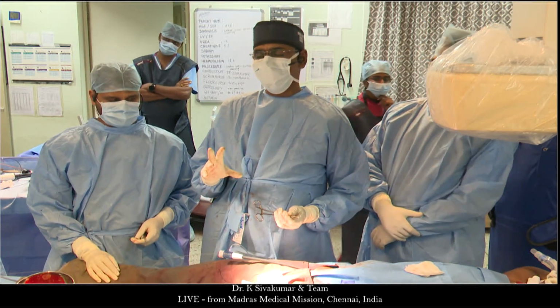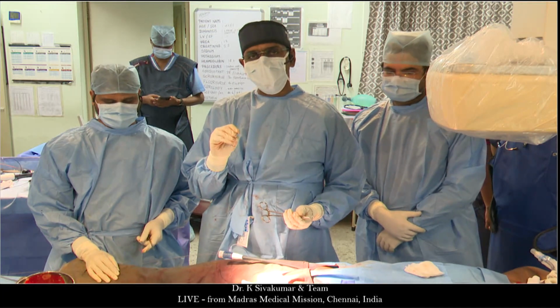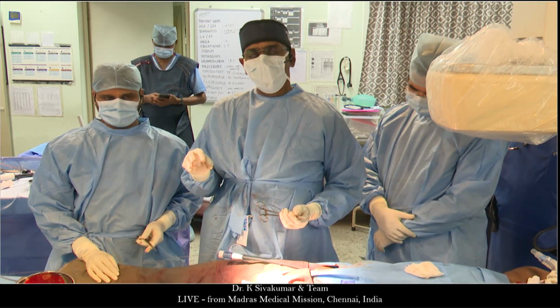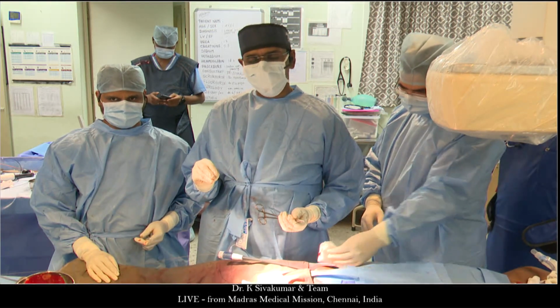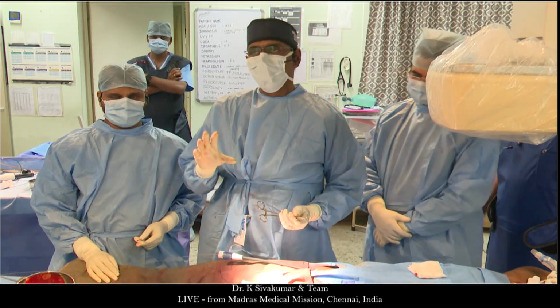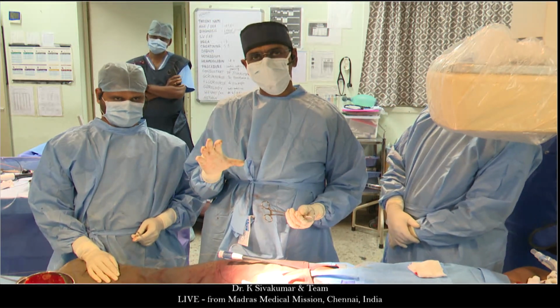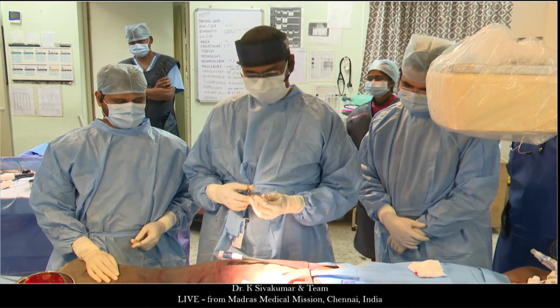The reason being, these are veins that are very small, measuring 8 millimeter or 9 millimeter. If I go and put in a balloon and create some minor endothelial injury, they will be the harbingers of further pulmonary vein stenosis. So we try to avoid unnecessarily causing an endothelial injury on the pulmonary vein.